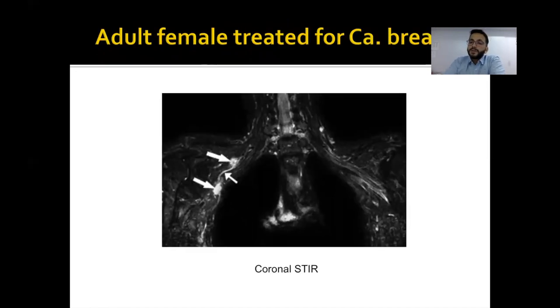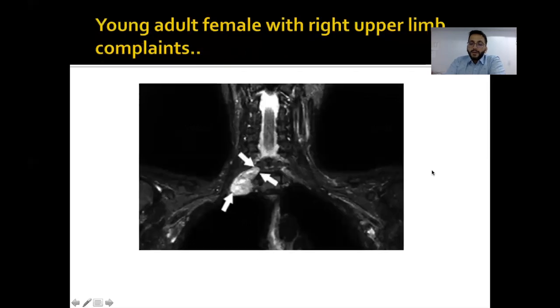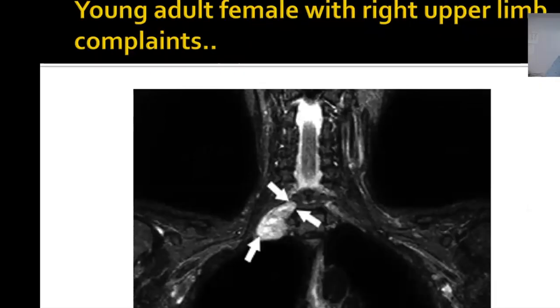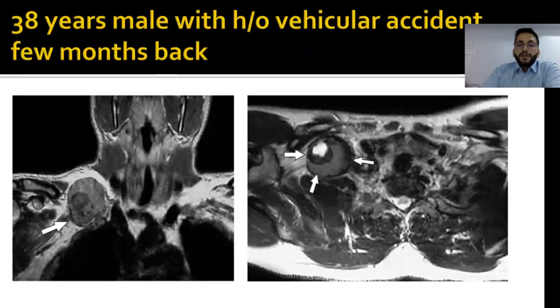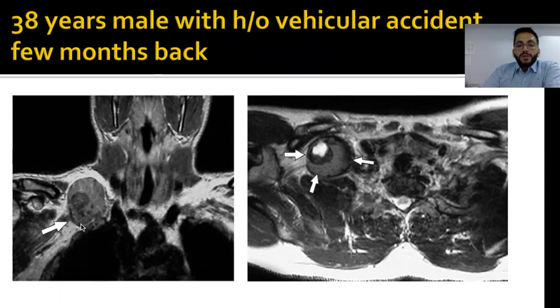Another patient — an adult female being treated for carcinoma breast — showed nodular lesions along the brachial plexus, classical of metastases involving the brachial plexus. Another young adult female with right upper limb symptoms had a characteristic dumbbell-shaped lesion coming out from the neural foramen with well-defined margins, most likely a nerve sheath tumor involving the brachial plexus. A 38-year-old male who had a vehicle accident a few months back now presents with right brachial plexopathy. Imaging shows a well-defined lesion with two signal intensities, representing a subclavian artery pseudoaneurysm causing right-sided brachial plexopathy.